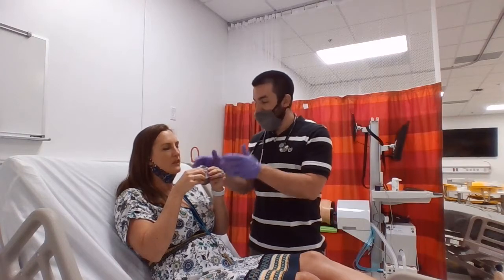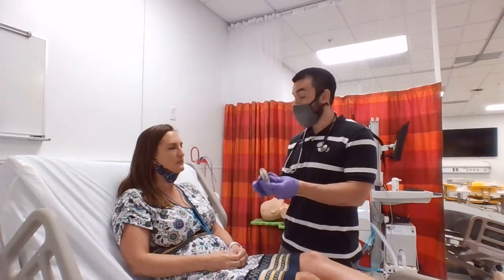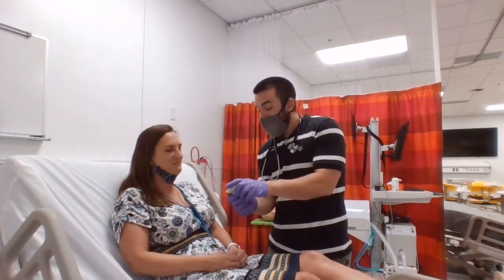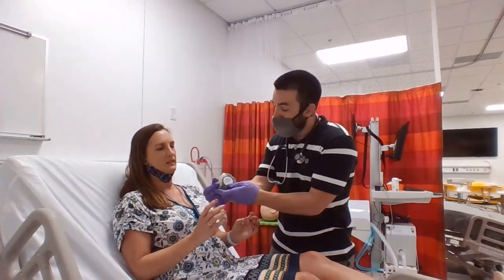Whoa, hey, don't blow on it. Did you see all the powder shoot out? Hang on. Because I really want you to get your dose, we're going to say it's wasted, even though we probably got some topical effect here. All right. So look, now that I just did all that, we got 59. I'm going to go ahead and puncture it again.